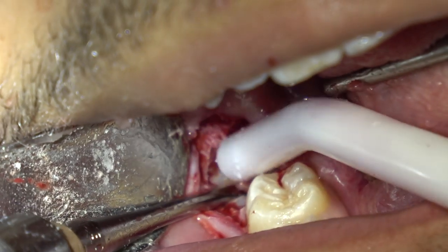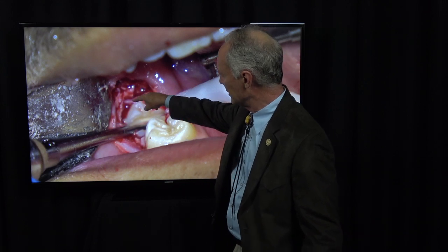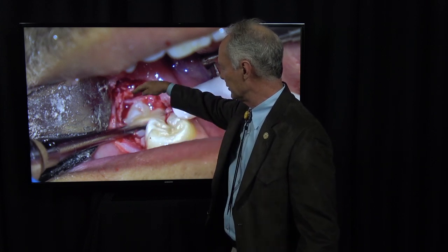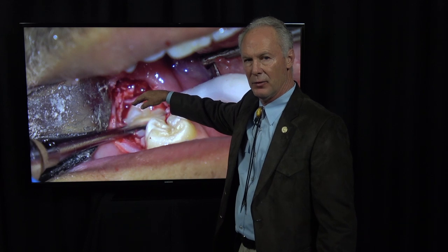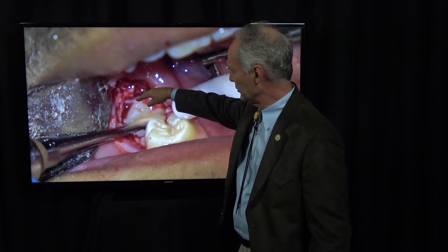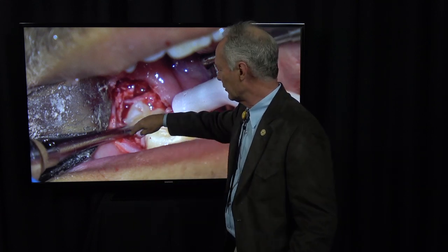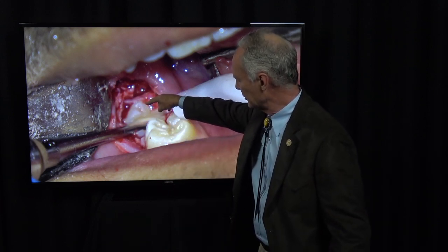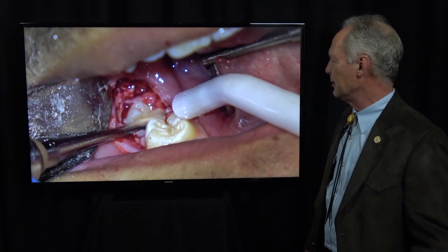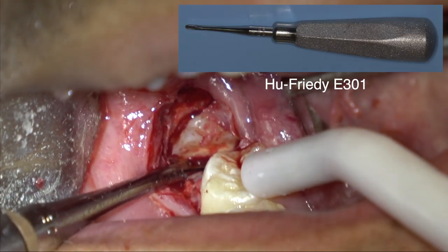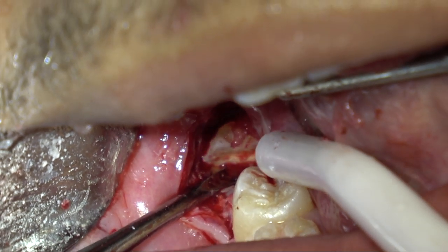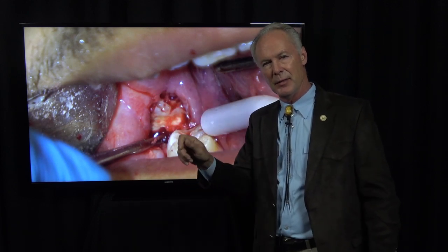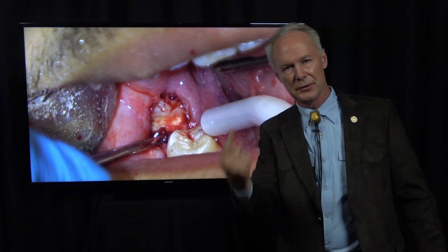I've removed some tooth, cutting primarily into the tooth on the distal and the facial more than the bone, so I can elevate that piece into a space. If you don't have a space into which you can elevate that tooth, it can't go anywhere. You've got to create that space on the distal and the facial. Then I've sectioned the distal part of the tooth from the mesial, and now I'm using an E301 elevator to move that distal part into that space.